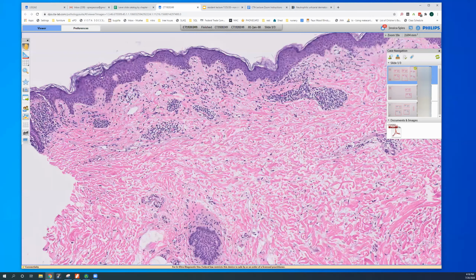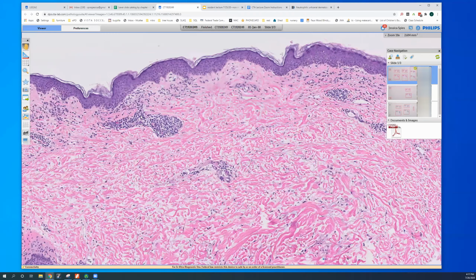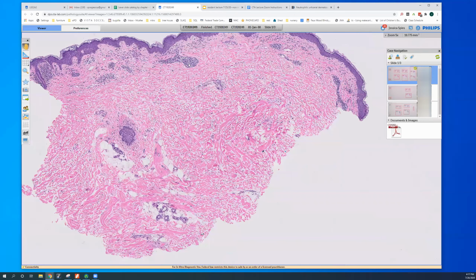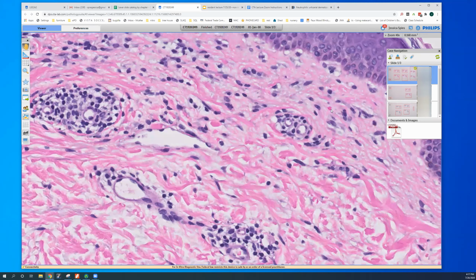And then the infiltrate, if you look at it at lower power, it's kind of strikingly perivascular and has what we call a coat sleeve appearance. The lymphocytes are really hugging the vessels. And so that's really characteristic of EAC. And in the deep variant, you get this, but down here as well. And I have an image to show you that. So the infiltrate is usually mostly lymphocytic, but it can have some eosinophils. There are often some extravasated red blood cells, like we see here, these little refractile guys.